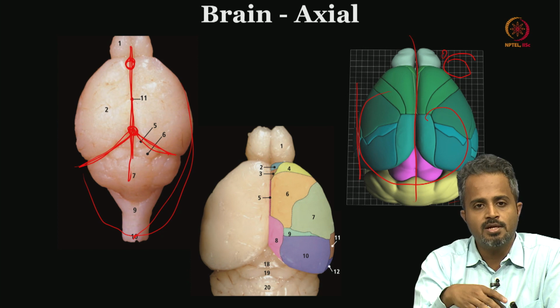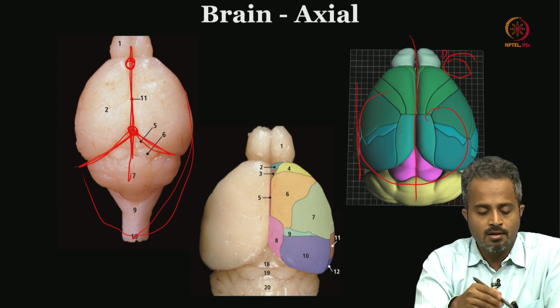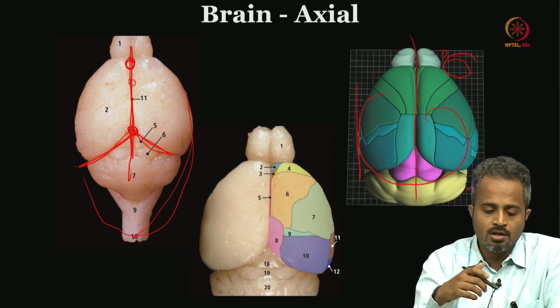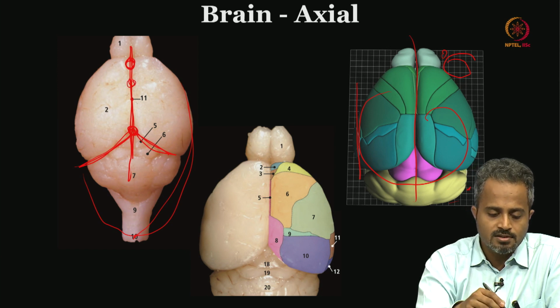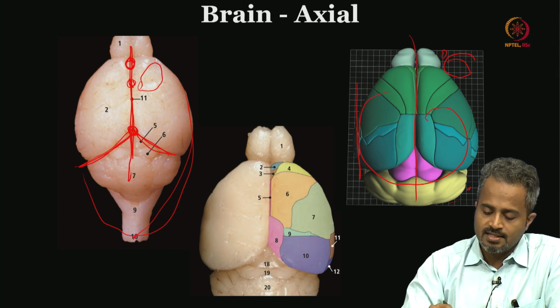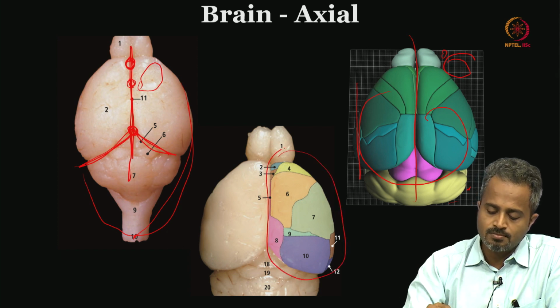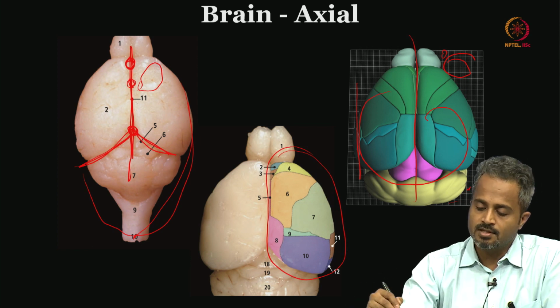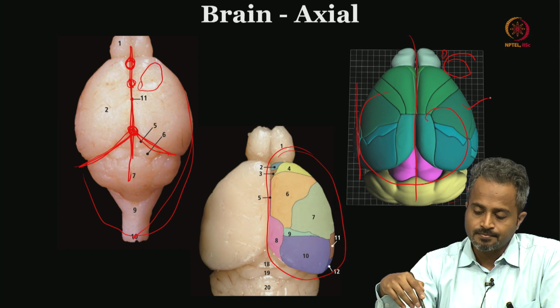That will be completely based on the stereotactic coordinates, because once you identify the bregma you can clear it in the digital acquisition system of the stereotactic apparatus as 0. That would be our 0 point, which lies somewhere between the olfactory tubercle and the motor cortex. In this picture it is very clear what is motor cortex and what is sensory cortex, and that is further broken down in this particular 3D model.